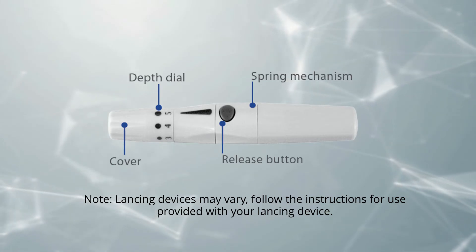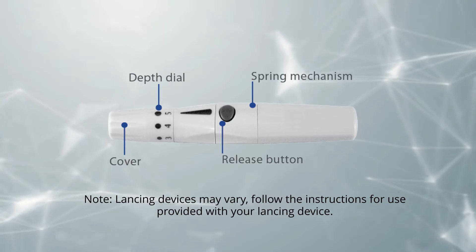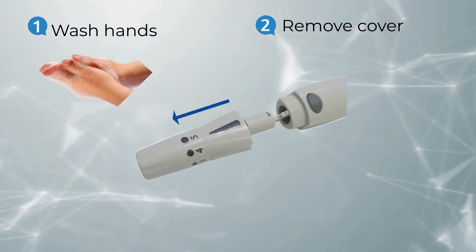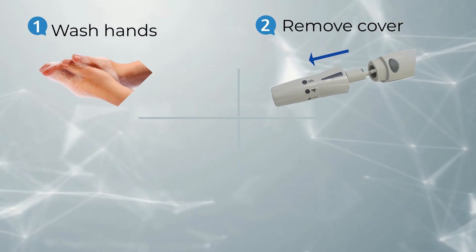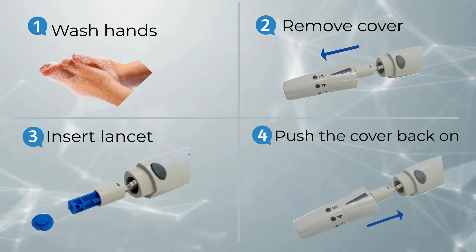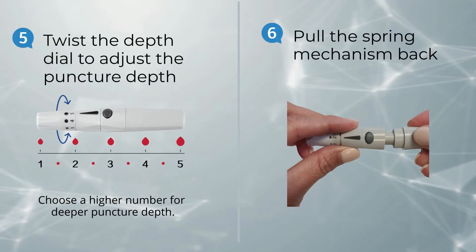Lancing devices may vary. Follow the instructions for use provided with your lancing device. Always start by washing and drying your hands. Prepare your lancing system by removing the lancing device cover, inserting a lancet into the lancing device, and replacing the lancing device cover. Twist the depth dial to your desired puncture depth and pull the spring mechanism back to arm your lancing device.